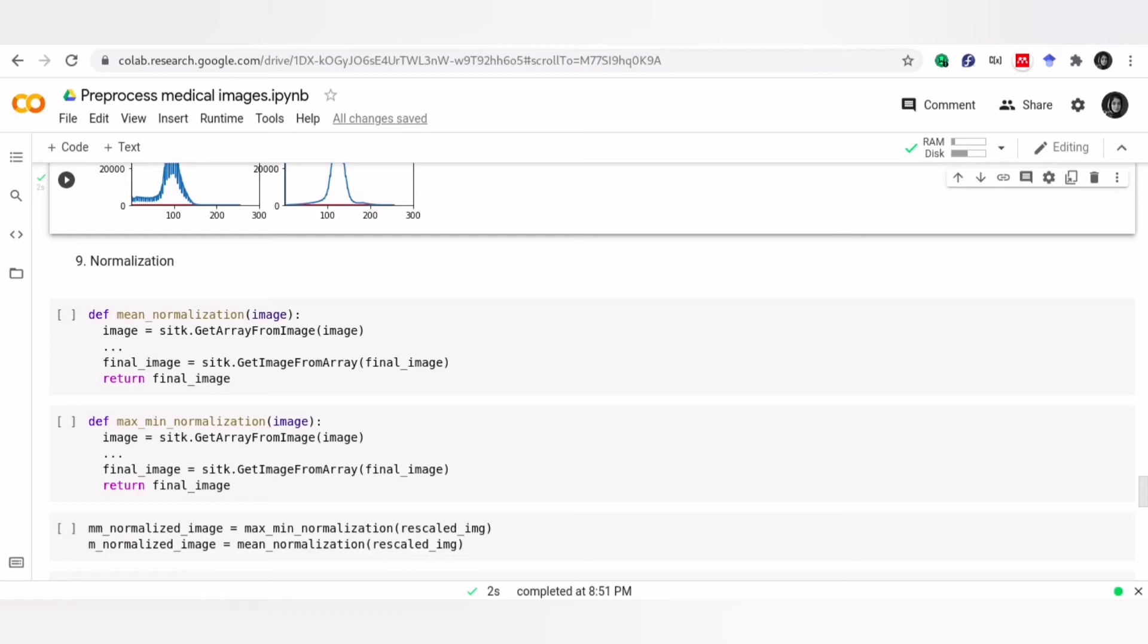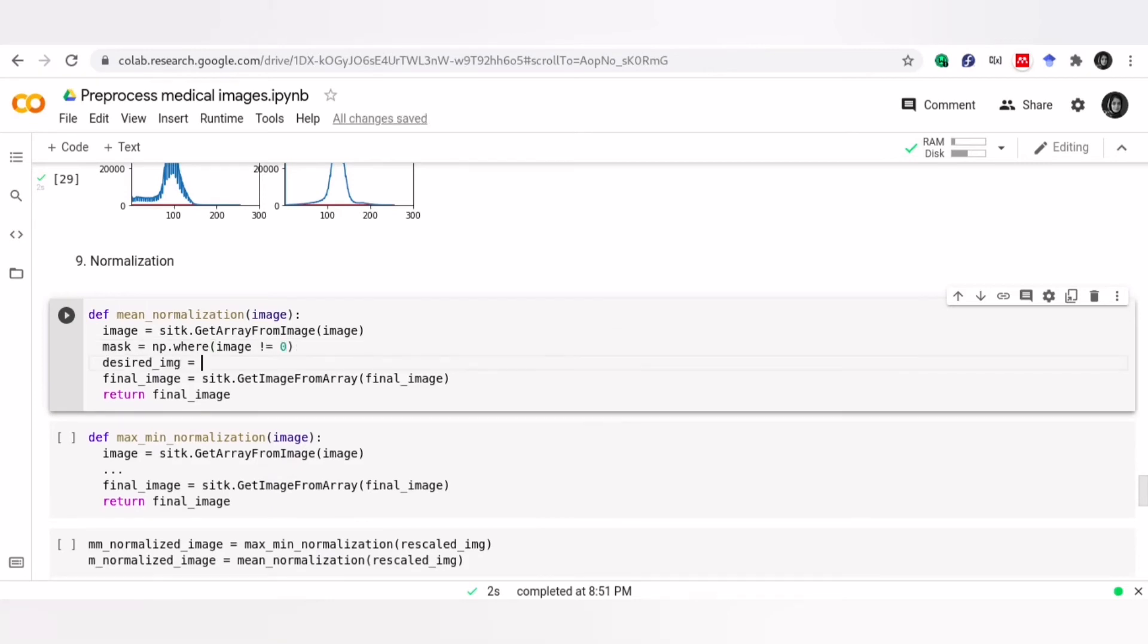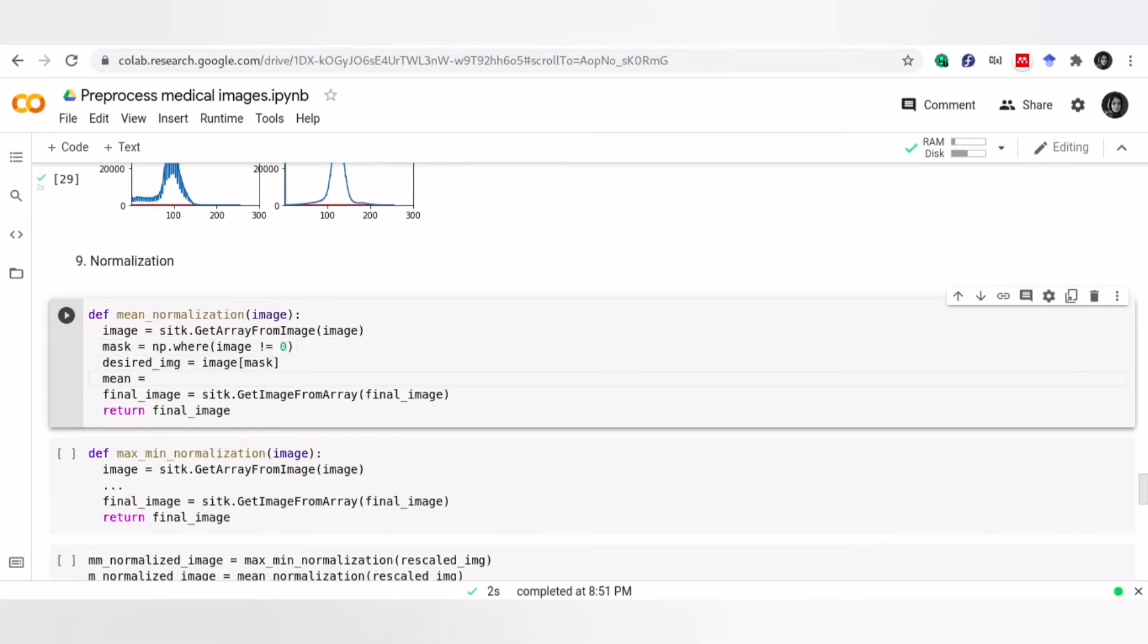Because we don't want to normalize the brain area or any other organisms with the intensity of the voxels around them. So, first, I omit zero-intensity voxels, then calculate mean and std, and use them for normalization.